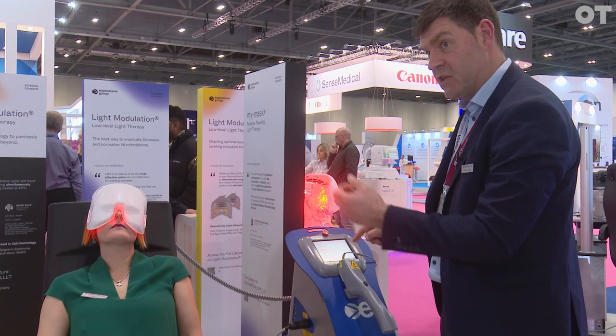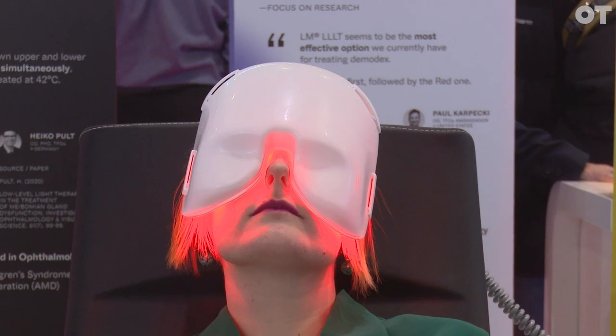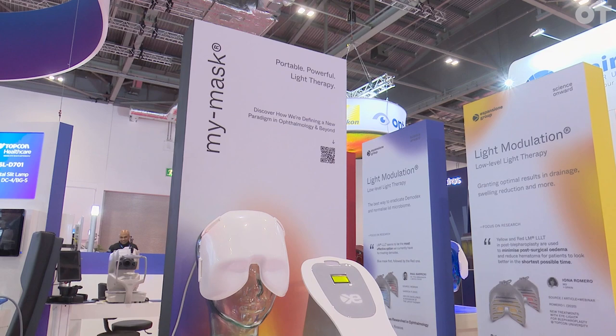We select light modulation, which is low-level light therapy, and then we just click enter. And you can see from the mask when I start the procedure, the light in the mask will intensify — it'll become a very bright red. And the patient just relaxes there for 15 minutes wearing this mask. It's almost like you're lying on a beach on a lovely sunny day — that feeling you get with a nice warm sun on your face.